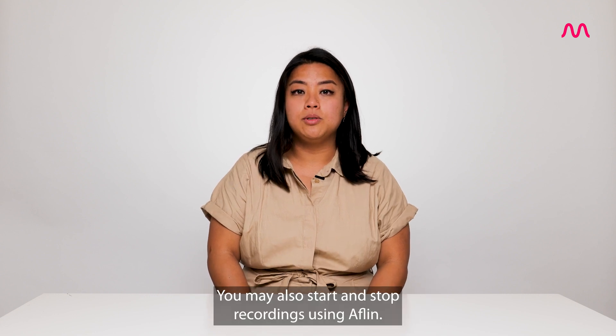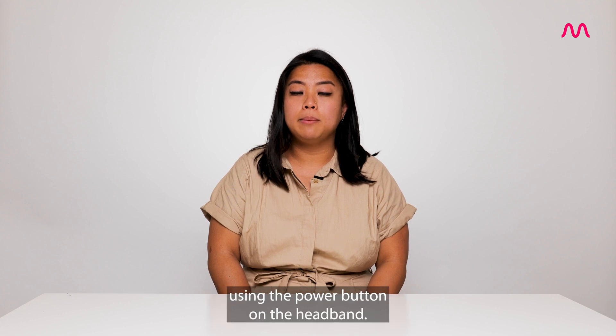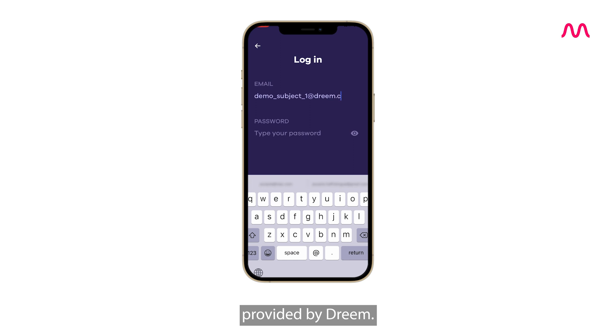You may also start and stop recordings using Alfin, however we recommend that this is done manually using the power button on the headband. Once you have downloaded the Alfin app from the Apple or Android store, you will open the app and proceed to log in with the credentials provided by Dream.